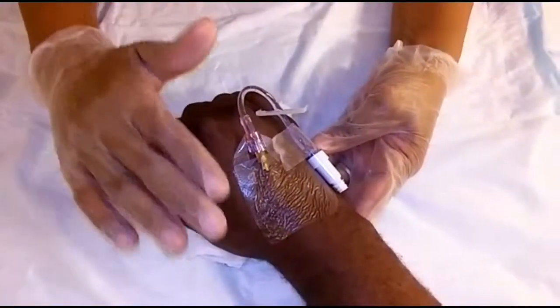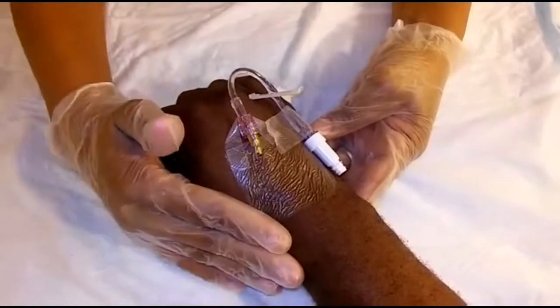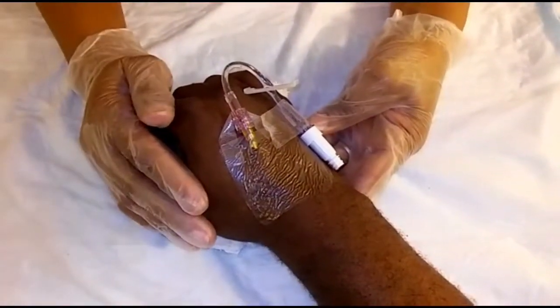I have secured the tape onto the patient's hand, and this is how you perform your peripheral intravenous access.